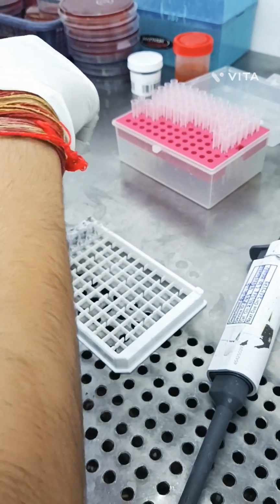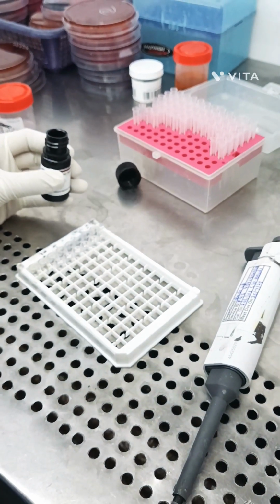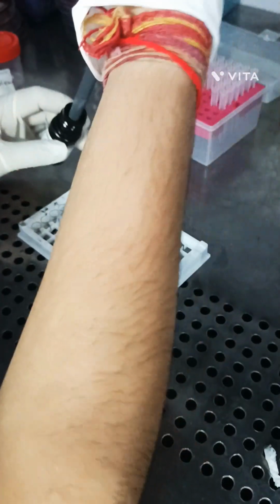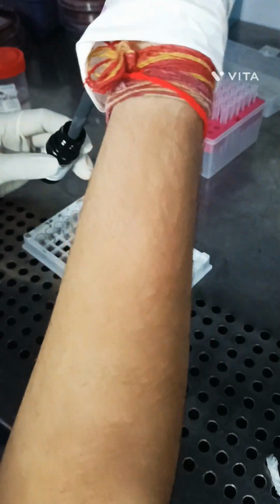The enzymatic reaction between chromogen A and B solution and the HRP conjugate produces blue color in the standard wells and in the interferon gamma positive sample wells.